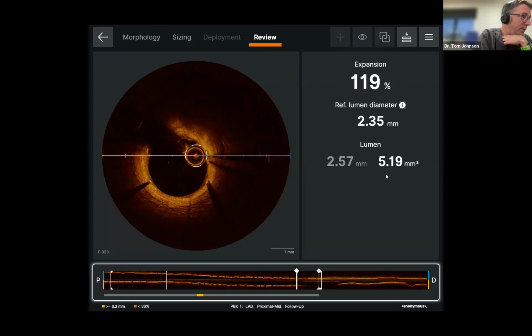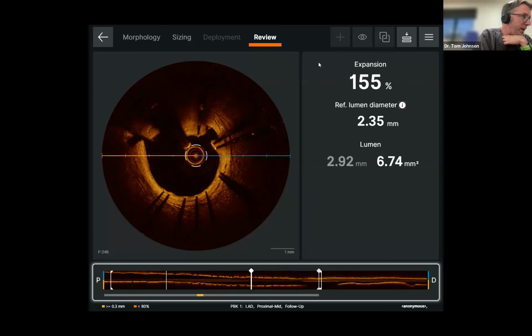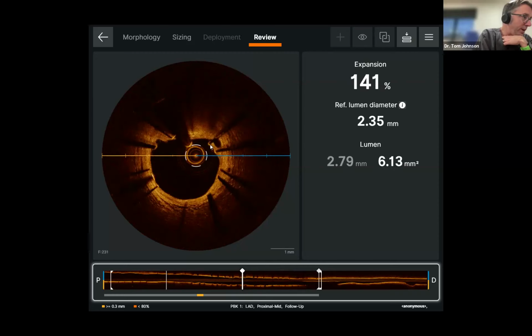healing of that stent. We did see that I'd left behind a couple of areas of malapposition, and here we see still, just due to the eccentric nature of the vessel, that there are some areas where there are still gaps behind the stent, but again, a very decent lumen. But importantly, you see that these struts have been covered. So we can see, if anything, this might be thrombotic material that will then endothelialize, if not already.